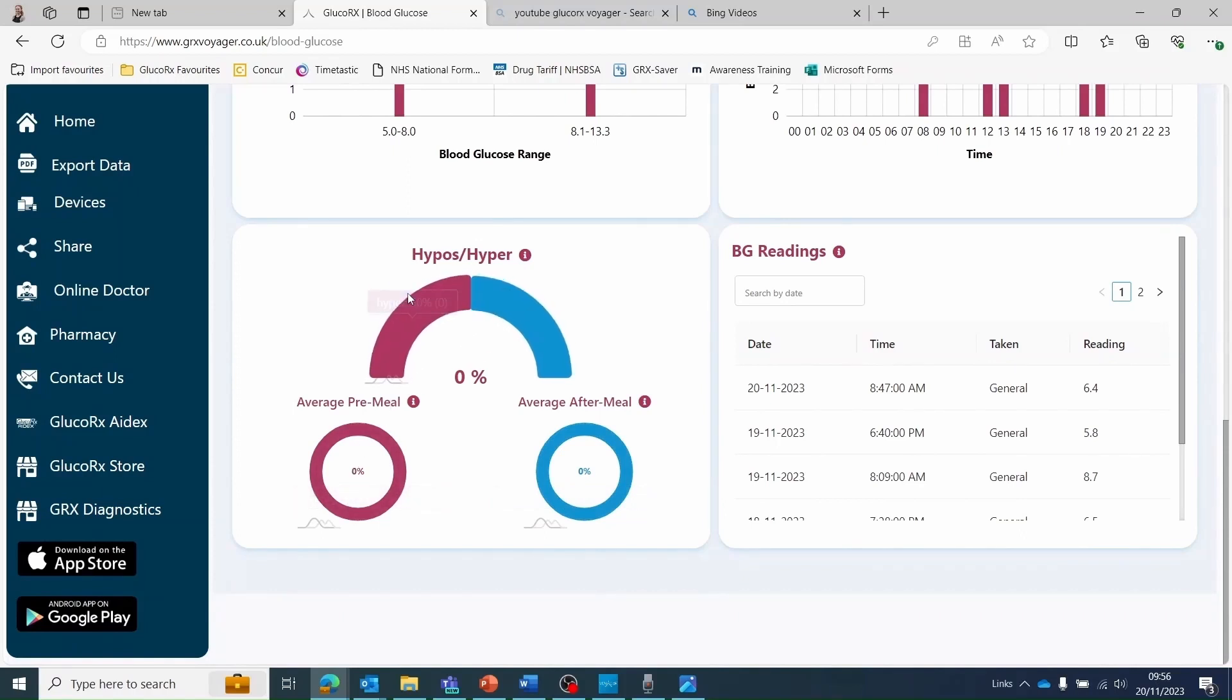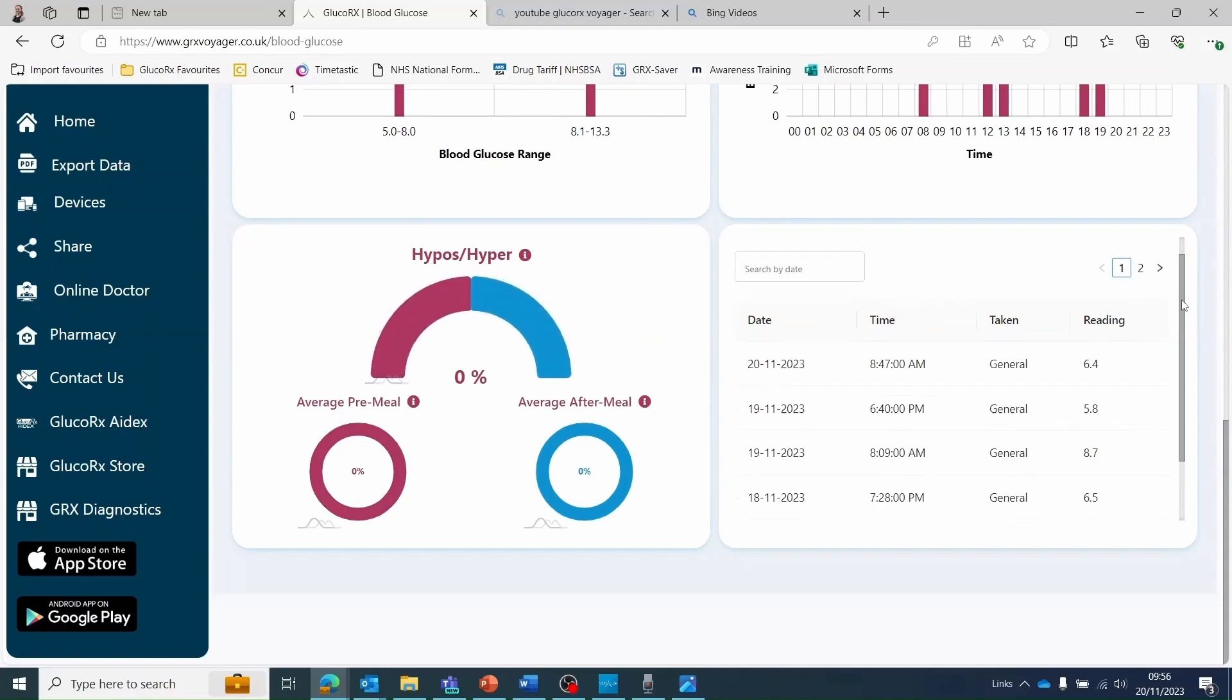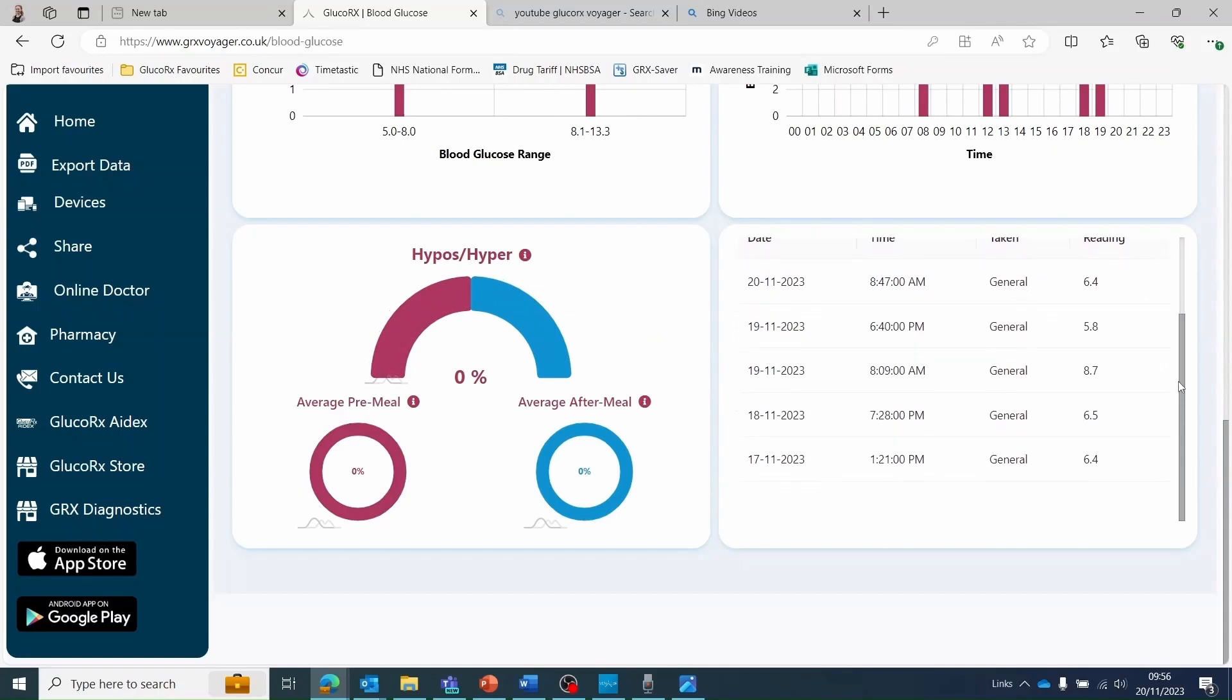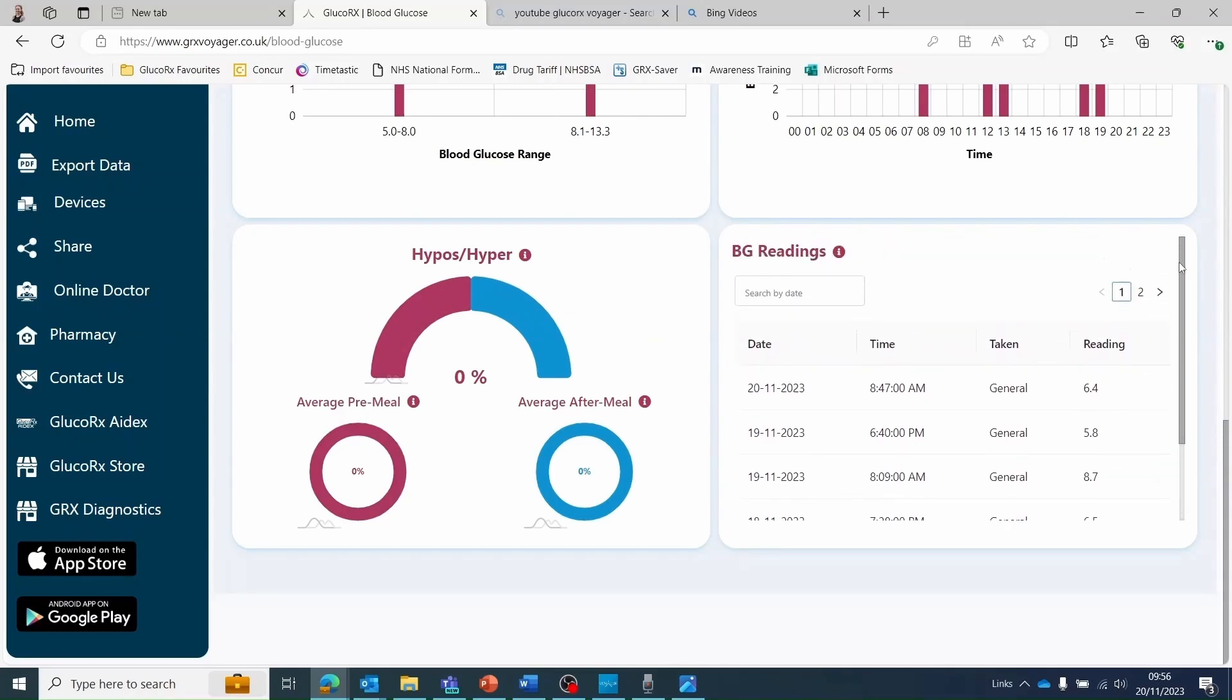The final table is a list of all the blood glucose readings that have been uploaded for the date range specified. This gives exact information on the date and time of the test, what mode was selected for the testing, and for example any meal tags, and the result.